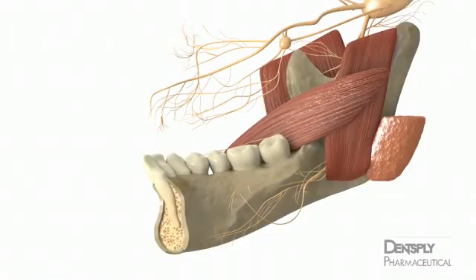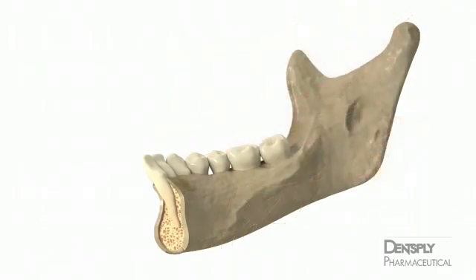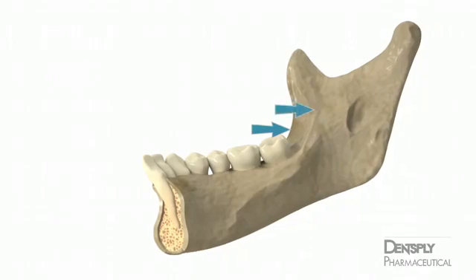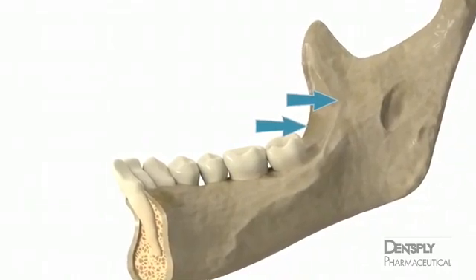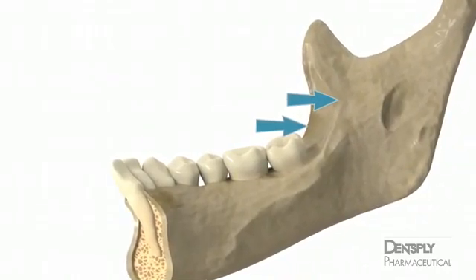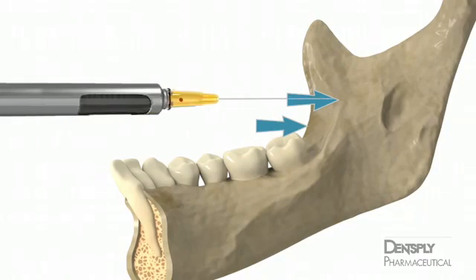The prognathic mandible represents a special challenge because in this case, the greatest concavity of the coronoid notch is not predictive of the mandibular sulcus, which lies some distance superiorly. Therefore, in patients with class 3 malocclusion, the insertion point should be made 1 centimeter above the line bisecting the thumbnail.